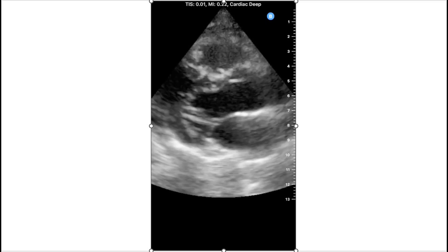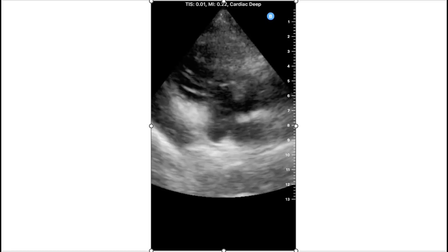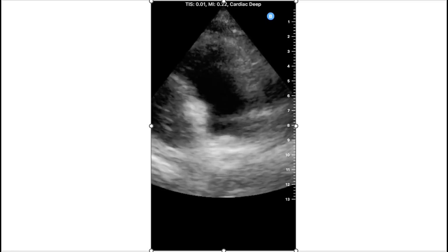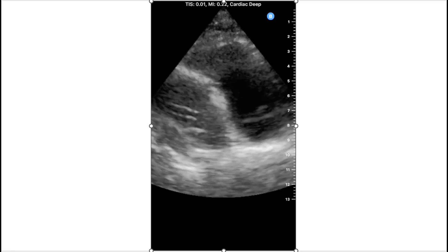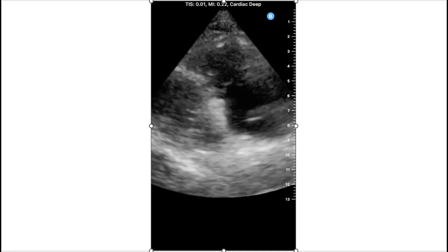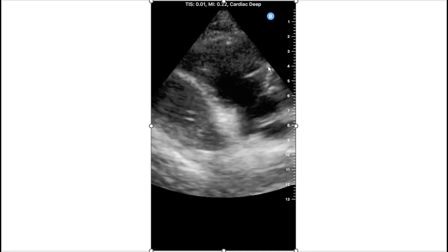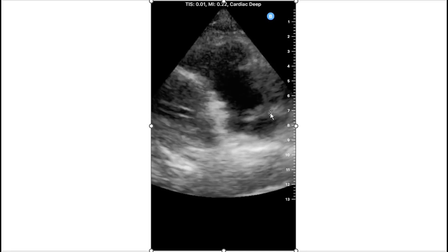Parasternal long axis — tilting the transducer towards the right hip. This is the RV, RA, and these are the tricuspid valves.